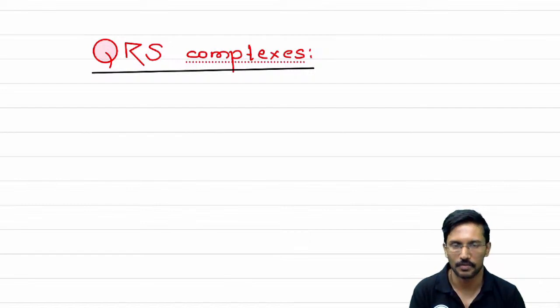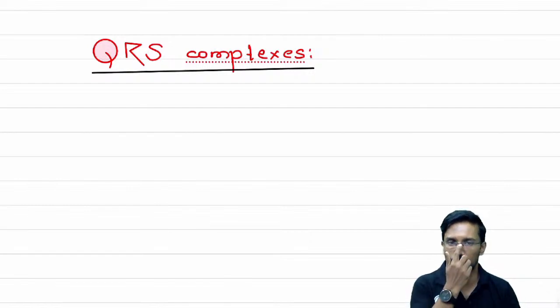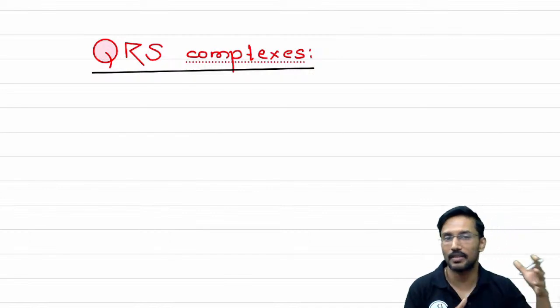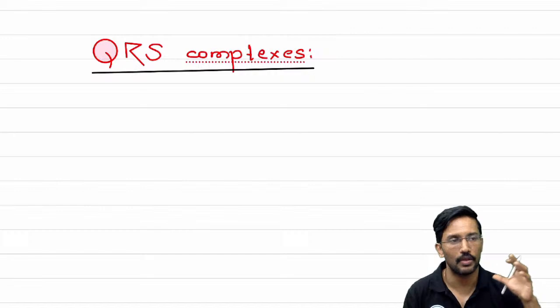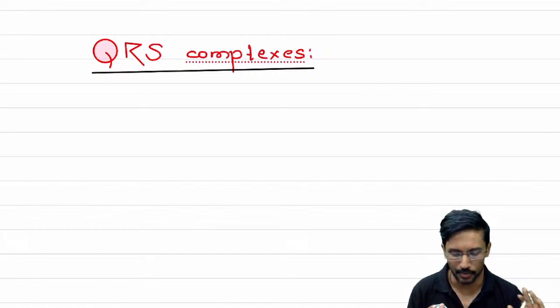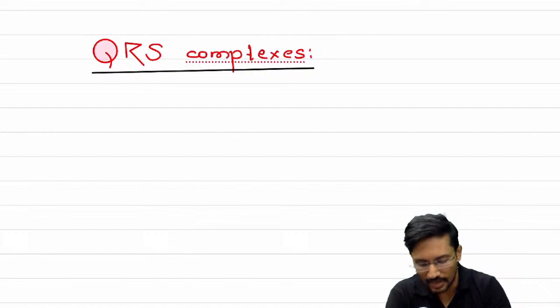the QRS complexes. Today's session is only for 10 to 12 minutes, addressing some key points about QRS complexes and understanding their utilization when it comes to clinical diagnosis, or how we can use QRS complexes in making the diagnosis of certain disorders. Okay. तो ये QRS complexes क्या represent करते हैं?